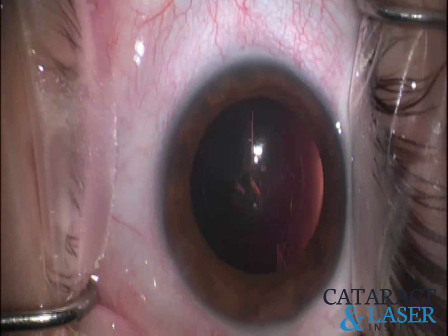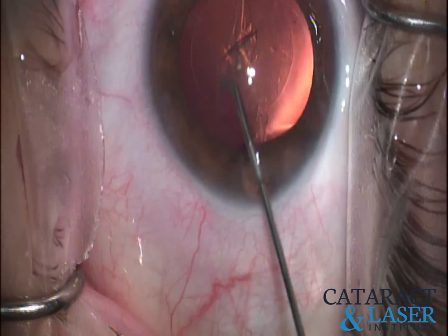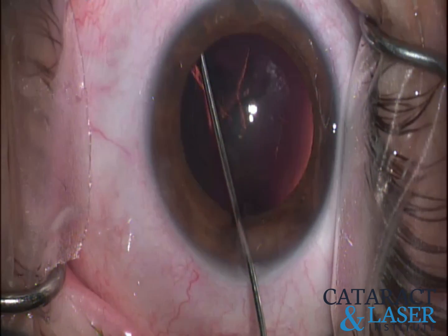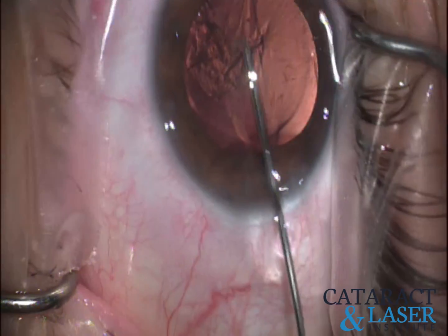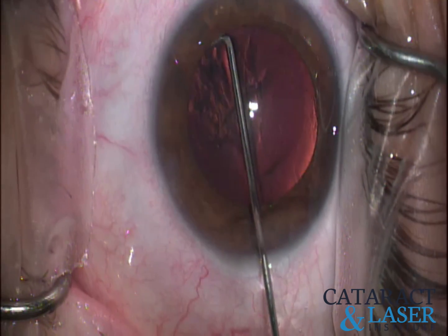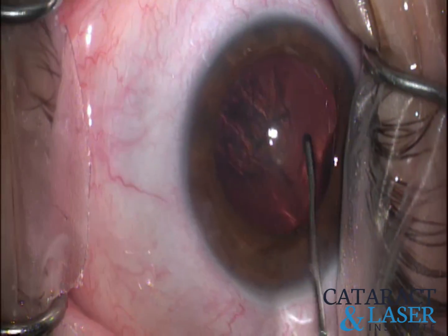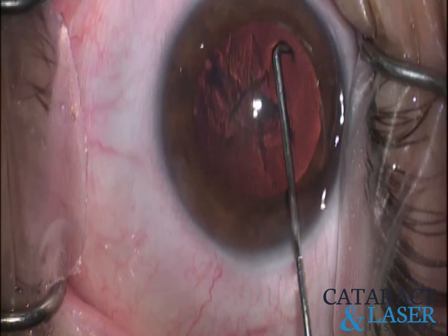We're getting set up for hydrodissection. I'm not going to do my normal thing where I go up into the superior or inferior nasal quadrant, see a nice wave, and then go to the opposite side to dislodge the lens. Instead, my goal is to actually force the entire lens via hydrodissection to either tilt up or pop into the anterior chamber.